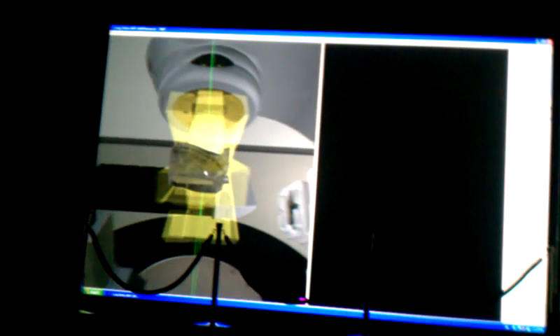The interesting thing for you guys to know is, many of you may have heard in the news about a year ago, some patients in New York were actually killed because of overexposure to radiation during their radiation treatment. The errors were simply related to the fact that those multi-leaf collimators were not working. They were not turned on. So instead of shielding parts of the patient, the entire field got irradiated, and it was enough to kill 2 patients.